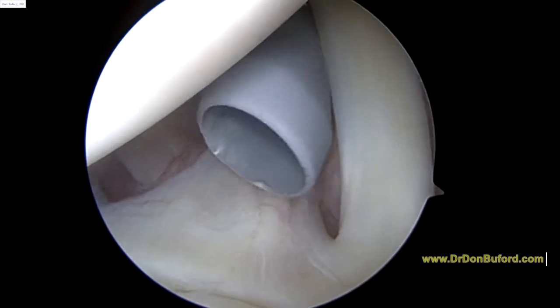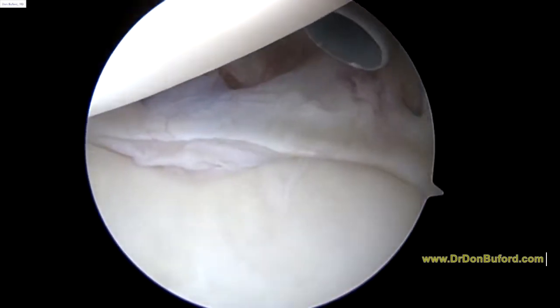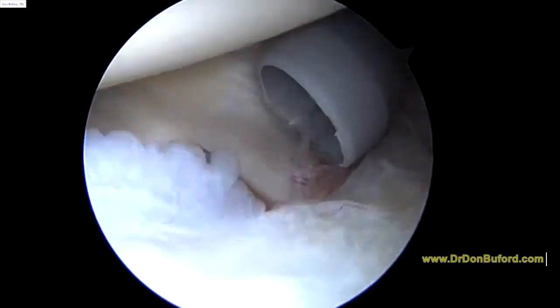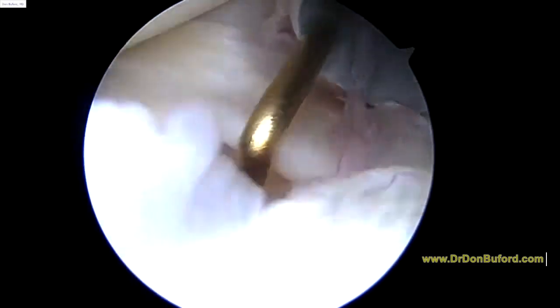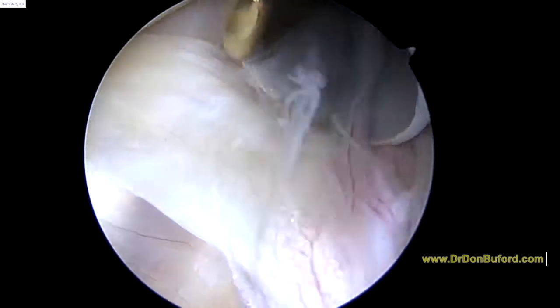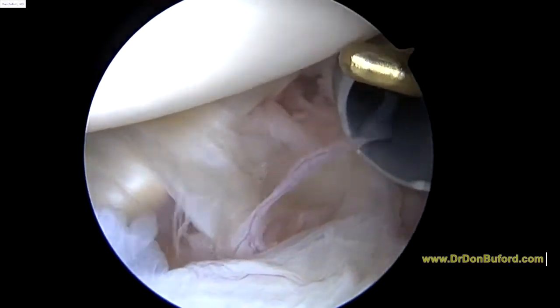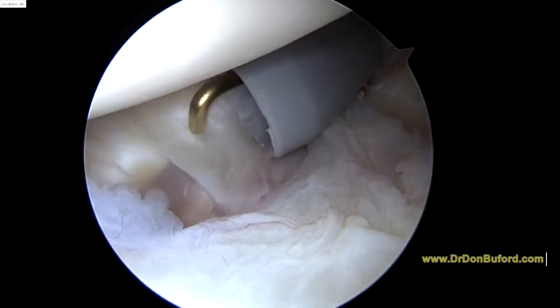The anatomy in the front of the shoulder. I'm going to rotate around and show you a little bit better. So here we go. There's the middle glenohumeral ligament, this little wispy thing. This is the middle glenohumeral ligament. The tip of that probe is 1 millimeter. So we're talking about a structure that's 2 or 3 millimeters wide. It's really just a thickening in the capsule. And here it is right here. So this is the middle glenohumeral ligament.